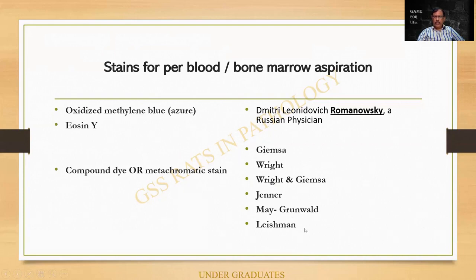If you are asked, you should answer, though we commonly use only the Leishman stain. Jenner, Wright, Giemsa, May-Grünwald. These are all modifications of the Romanovsky stains. Please do mention it.